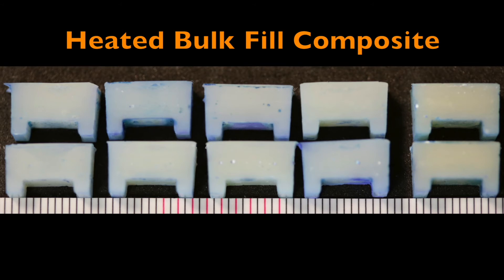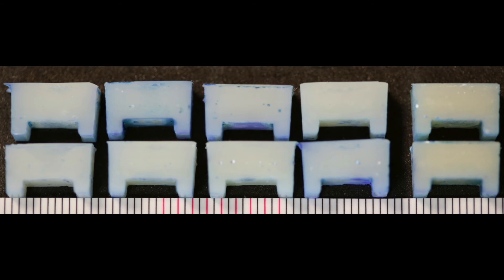Here we see an example of preheated bulk fill resins. As you can see, there are almost no voids and no knit lines in these ten restorations.